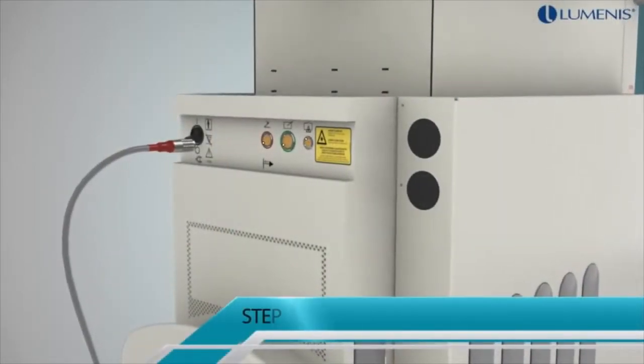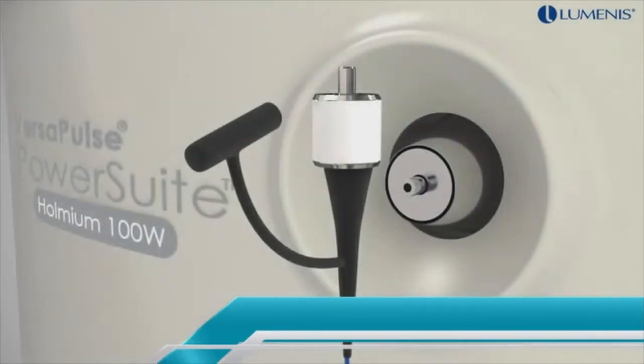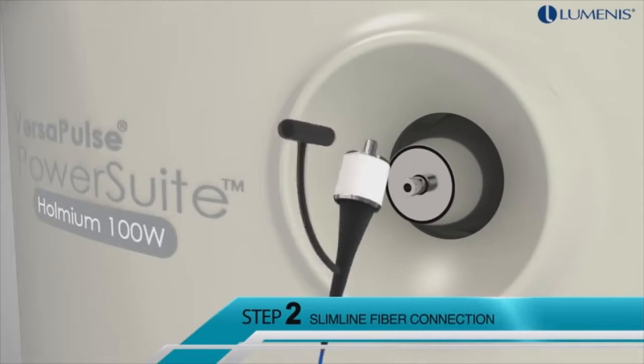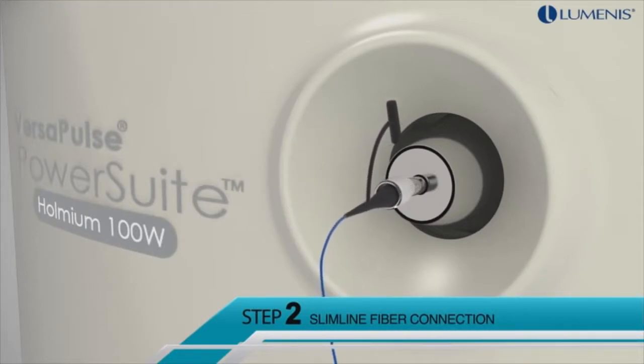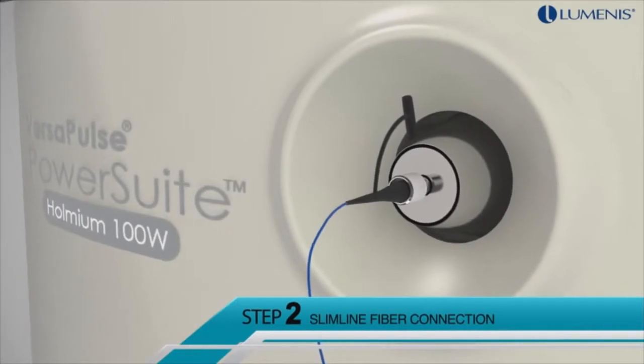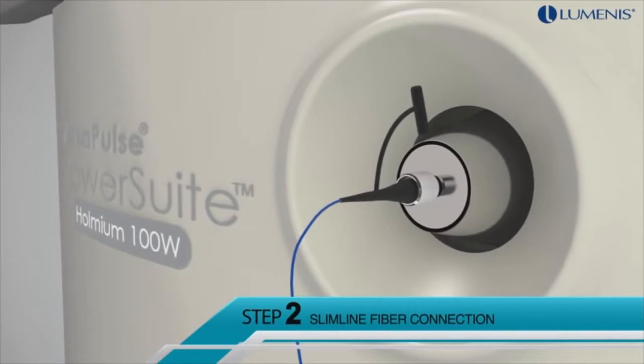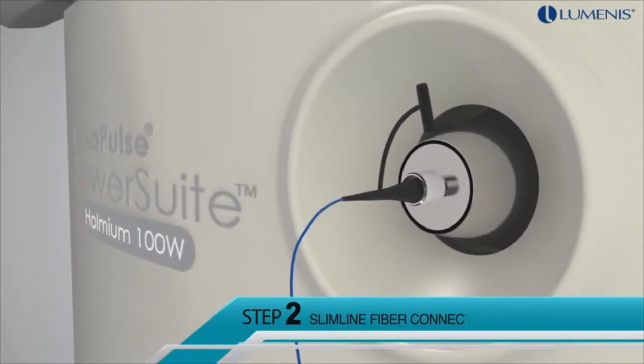The system setup includes five simple steps. Step 1: connecting the foot switch. Step 2: connecting the fiber. The VPPS 100W system is optimized for use with the Slimline family of disposable or reusable fibers. For HoLEP, the Slimline 550 micrometer is the most suitable fiber.